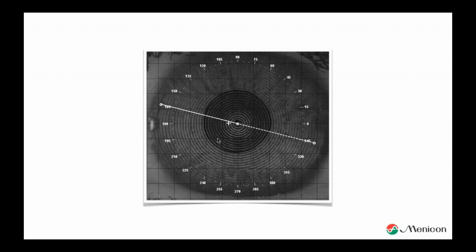That's an important thing, because what we're measuring with a topographer are the tangents, but we are not measuring the tangents from the eye itself, or from the cornea. We are measuring the tangent of the tear layer. We need a reflective surface, and the cornea itself is not reflective. So the tear layer makes it possible. And the assumption is that the tear film is exactly the same shape as the cornea. That's what the principles of reflective topography rely on.